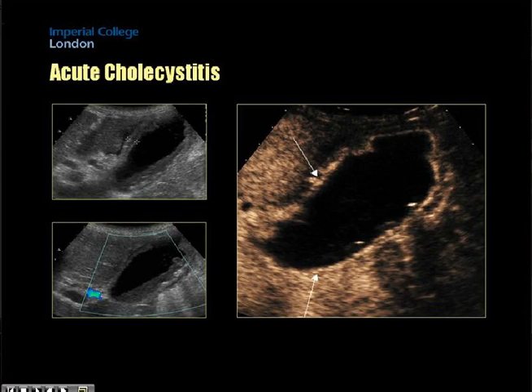Another case that can sometimes be confusing with cholangiocarcinoma is simple acute cholecystitis. But what you really want to make sure of is that there is no direct invasion from the swelling of the wall of the gallbladder into the adjacent liver parenchyma. As you can see here, with contrast, you get clear delineation of the swollen walls of the gallbladder and no invasion into the adjacent liver parenchyma.